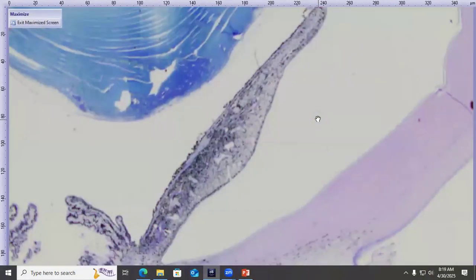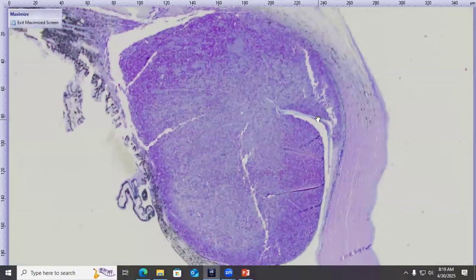All right, so kind of a straightforward diagnosis, but just an interesting one. I looked through our database, and there's really only a handful of intraocular mast cell tumors. I found like 5 or 6. And a lot of them we have limited follow-up. So it's hard to say if these represent metastatic mast cell tumors that have disseminated to the eye. I think 1 or 2 of them did have concurrent cutaneous or subcutaneous mast cell tumors removed. So likely those do represent metastatic mast cell tumors.